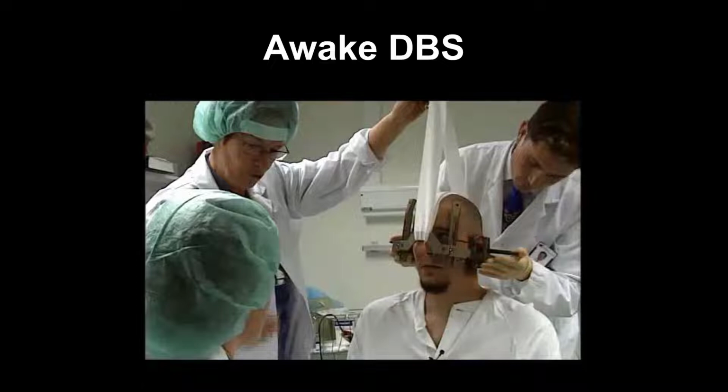The next step is the implantation of the electrodes. We can in this video of a man with hereditary tremor see how these procedures used to be performed at my department and how they are still done at most places around the world.